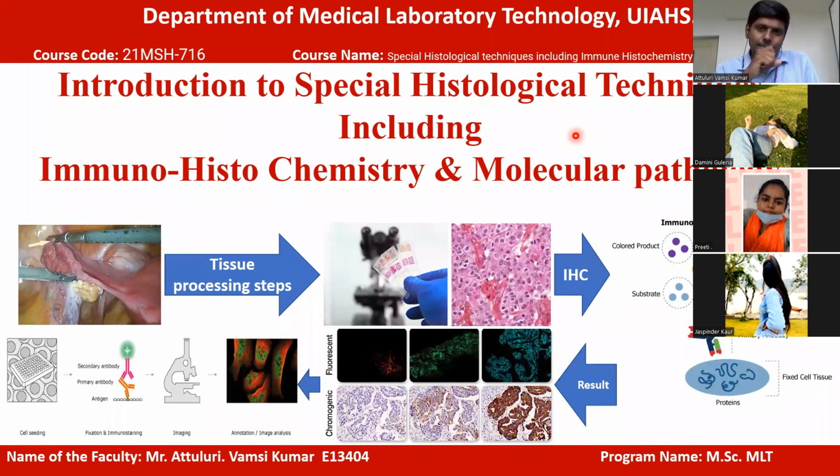Okay, but immunohistochemistry never gives me the data of the functional status of that enzyme. Are these 10 enzymes working in the heart or not? Maybe they are in normal number, they are 10, 10 is normal, but those 10 enzymes are not working.